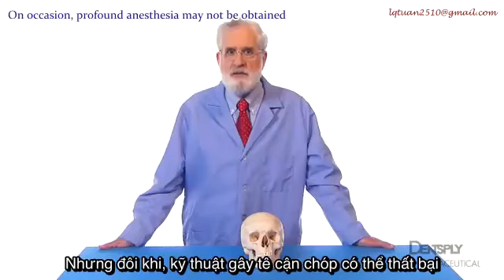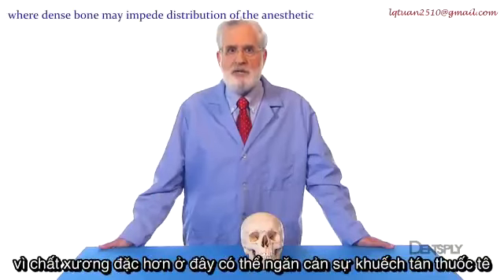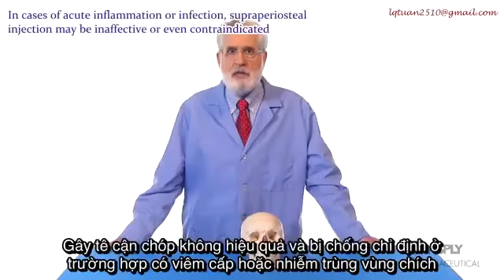On occasion, profound anesthesia may not be obtained, especially in the region of the maxillary first molar, where dense bone may impede distribution of the anesthetic. In cases of acute inflammation or infection, supraperiosteal injection may be ineffective or even contraindicated.